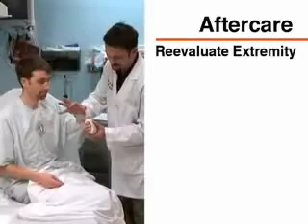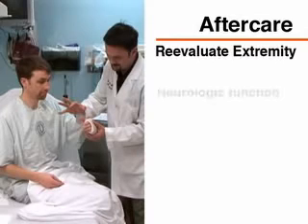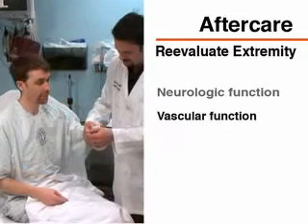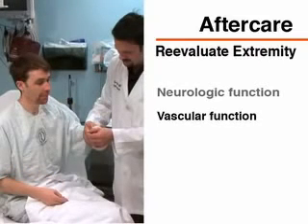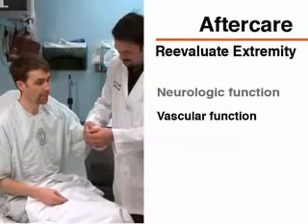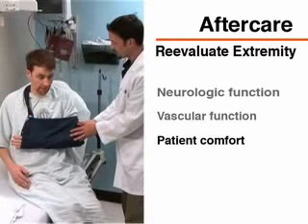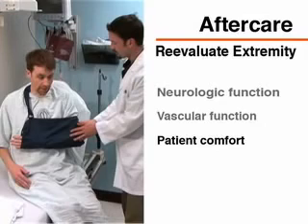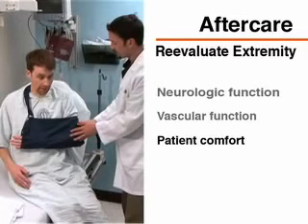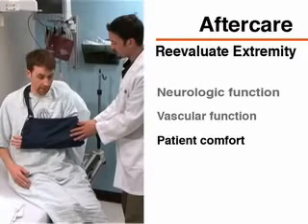Re-evaluate the extremity immediately after completing splint placement. Evaluate distal motor and sensory function, palpate for pulses, evaluate the color of the extremity, and assess for appropriate capillary refill. Be sure that the completed splint is comfortable and not overly restrictive and that the patient's pain is controlled. Address any discomfort by applying additional cotton padding or loosening the elastic bandage.